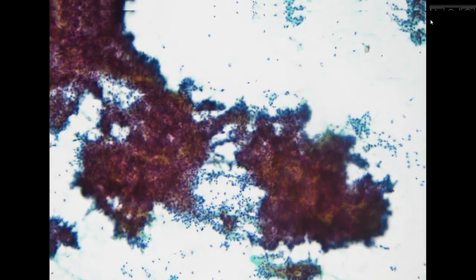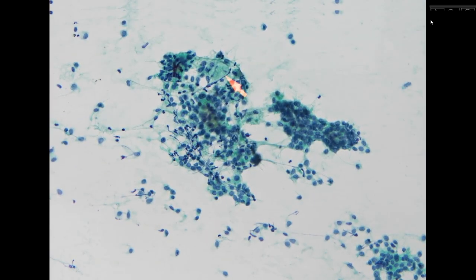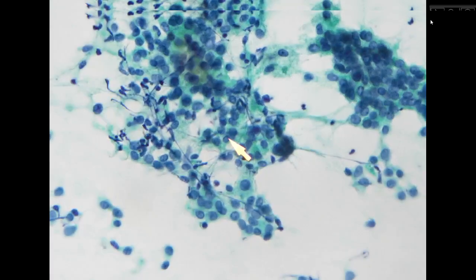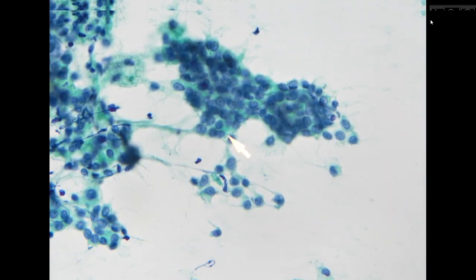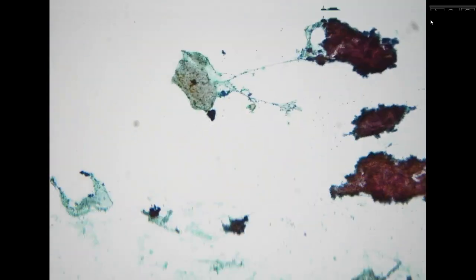So this is the direct smear. Basically, the direct smear shows very similar features. Some of the cells look pretty basaloid, but it can also be suggestive of a myoepithelial cell. Particularly, we can see these dissociated cells and some with a little bit of plasmacytoid feature. Still, it's kind of difficult to appreciate extracellular matrix material over here. But I think this dissociative pattern is pretty good for a myoepithelial component.